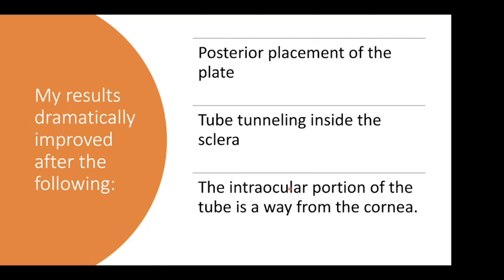And then just coming to the points which I think have shifted my career in this area. What are the secrets behind my great interest in the valves nowadays? First of all, it is the posterior placement of the plate. It is technically difficult, but I think it's very rewarding when the plate is very posterior because the Tenon's in the posterior part is very thin. I found this, the Tenon is very thin, that could help the better pressure. So I think that's something good.